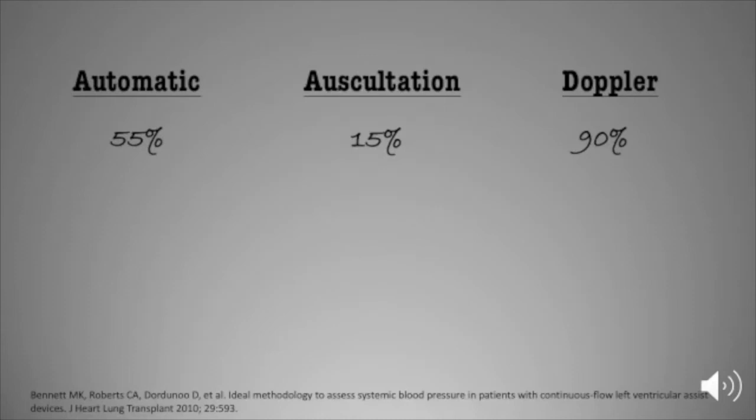So what does this practically mean to us? Well, since you're unable to do the Doppler at the scene and get 90% accuracy, we have to look at the patient and use common sense. We have to check for signs of perfusion. Do they have good cap refill? Are their extremities mottled, or do they look like they've got good blood flow? Some common sense plays in.